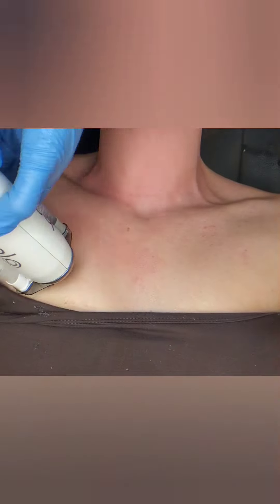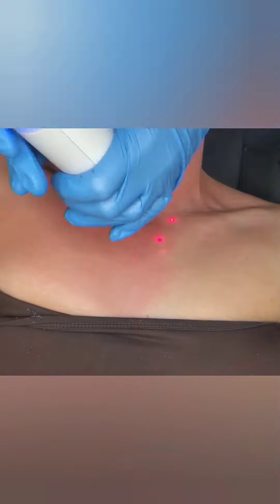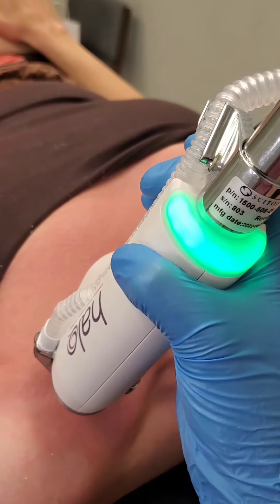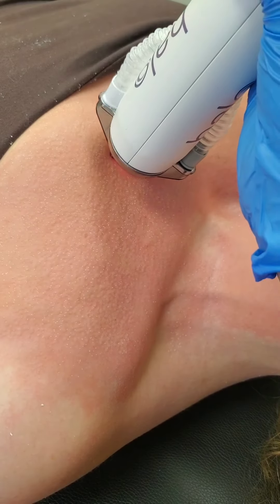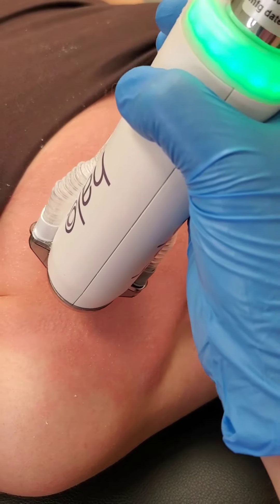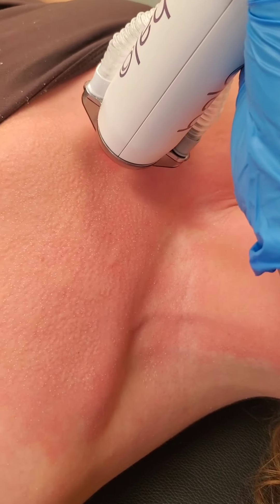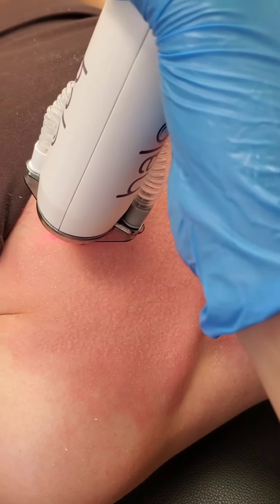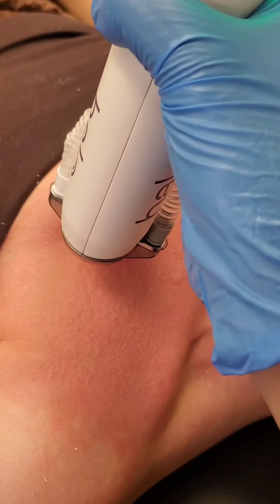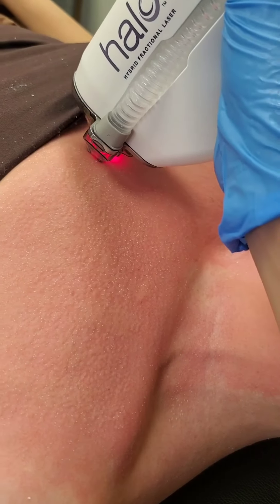I can add the chest at the same time as the face and neck, but I do need to know ahead of time because it's quite a bit of extra work and I'll need extra time — this video has been sped up. It will be an extra fee because it takes a lot of extra time and I need to charge appropriately. I probably wouldn't charge one full Halo treatment extra — I'd give you a discount if you're already doing your face and neck. But if you schedule it separately months later, we would have to charge the full price.